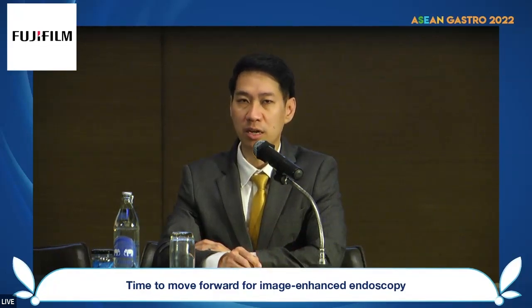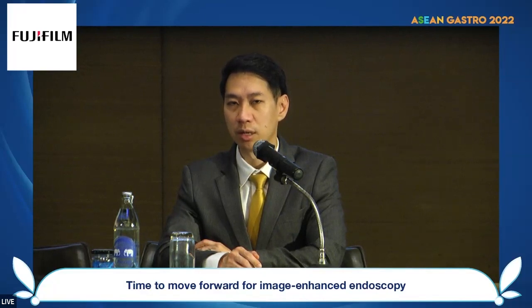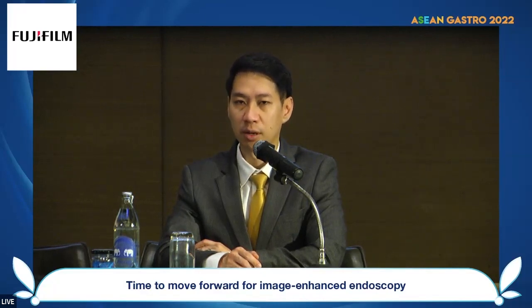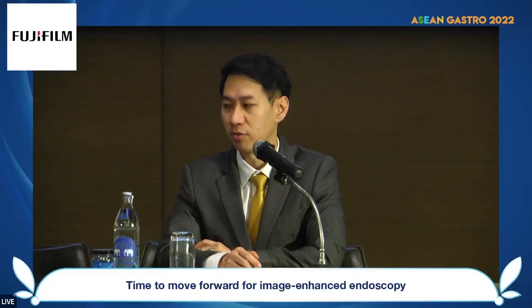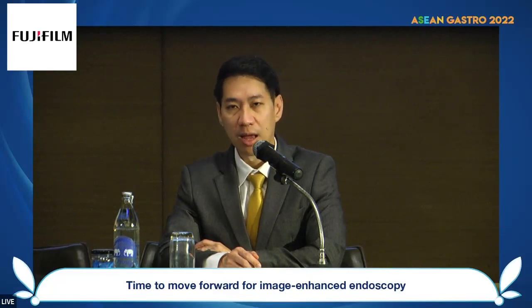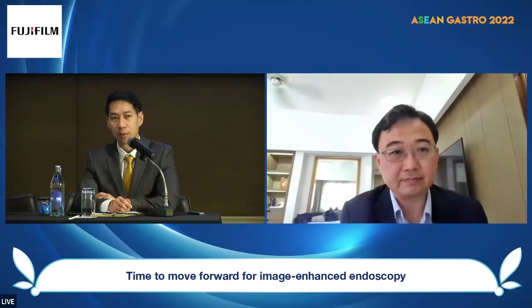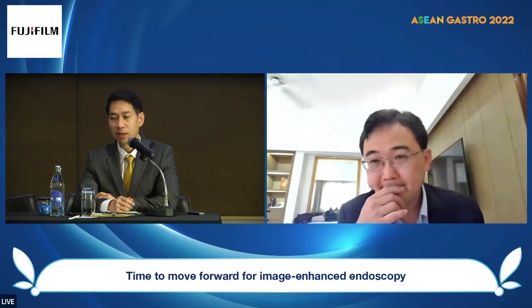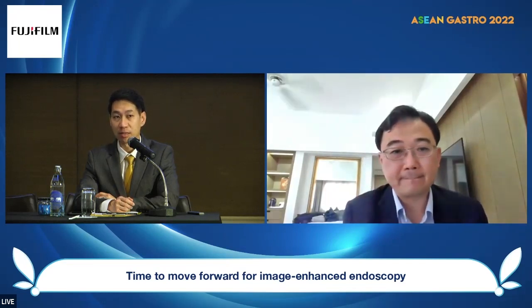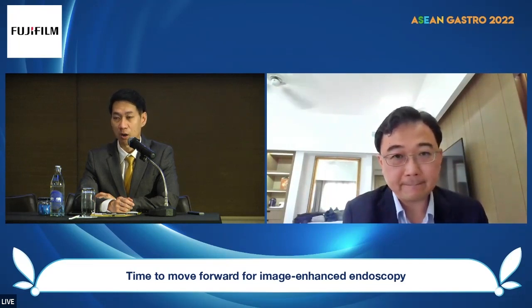One, we don't need an indwelling portion of the procedure, so it's technically easier. And two, in the past literature, it has been shown that the rate of acute pancreatitis and infected cysts was troublesome for ethanol ablation. And I think both of which have to be considered, especially for infected cysts. Because in these patients who do not have a good baseline from the beginning, ablation in infected pancreatic cysts can take a toll on them, and infection can make a difference in their outcome.